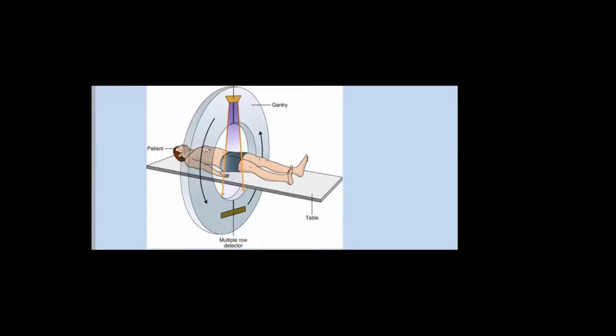If we say the spatial resolution is 0.5 millimeter, meaning it can detect different points when the distance between them is 0.5. Exactly. If it's 0.4, it will see them as one structure. They get fused together, so they will not be discriminated as two separate points. That's the spatial resolution.